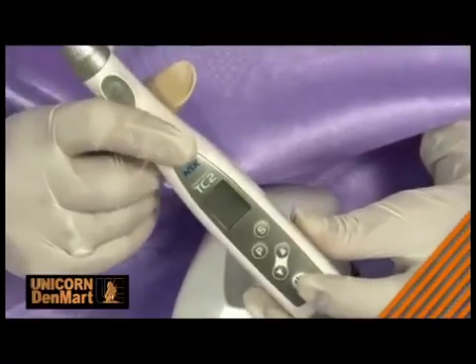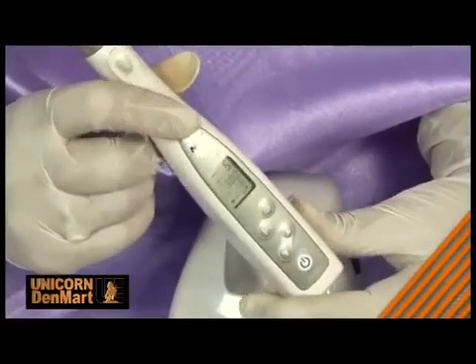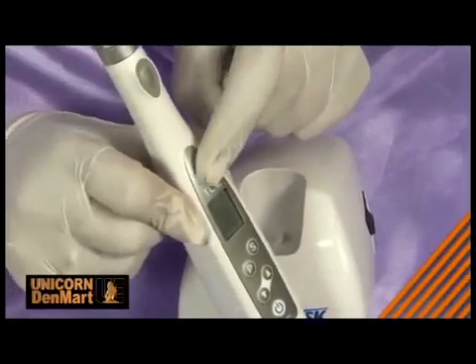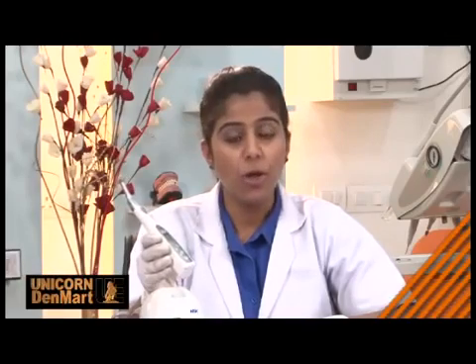Endomate TC2 has a dual control on/off switch. It can be operated either through a finger switch on the body or with an optional foot control. Endomate TC2 has easy-to-operate switches which can be used comfortably for long treatment hours.